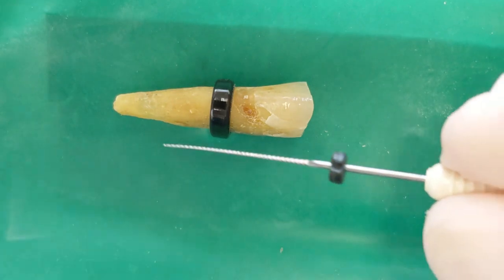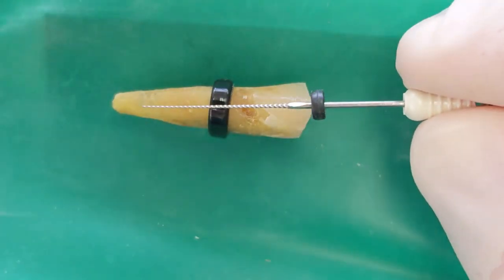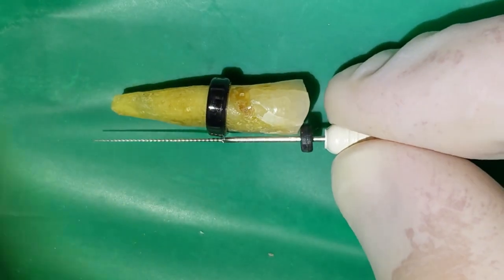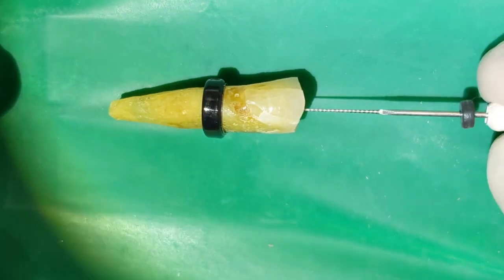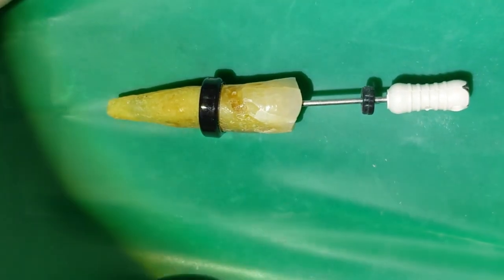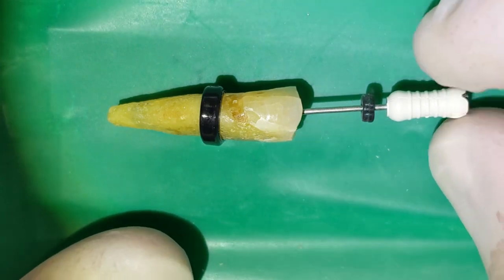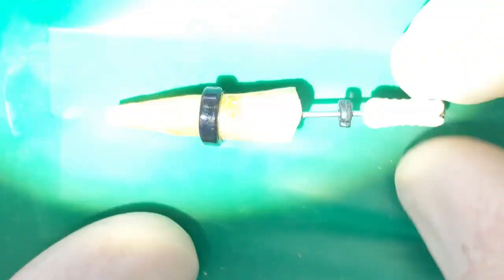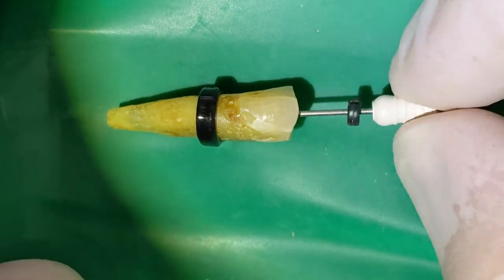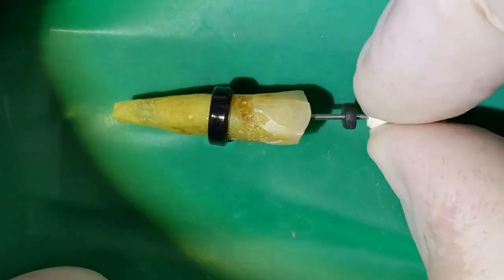Okay, I'm going to switch over to a longer file. This is the next file up too. It's a number 15, but it's also a bit longer. All right, so that'll give us enough length so you'll be able to see it come out the root tip. And just working it back and forth, a winding motion, just twist it back and forth, and just let it slowly advance.